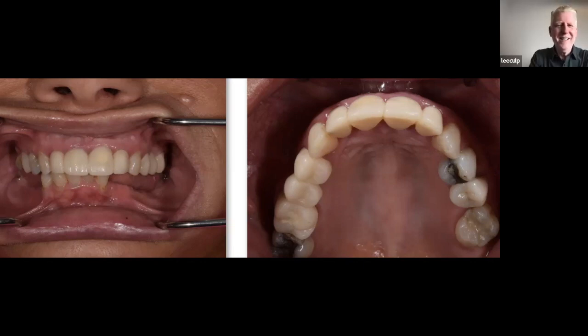Sure. And one of the things that's cool about the way we're doing it now, and we'll get into this when we do our all-on-4 talk, is being able to keep a few teeth for a while and put the implants exactly where the teeth were. You can make them a bridge essentially on 5 or 6 implants where they get to keep all their own gum. So there's no pink, or there's very little pink. And just think about that. As you get on that road, don't assume that everything is just a denture with 15 millimeters of space. It's gone so far beyond that.